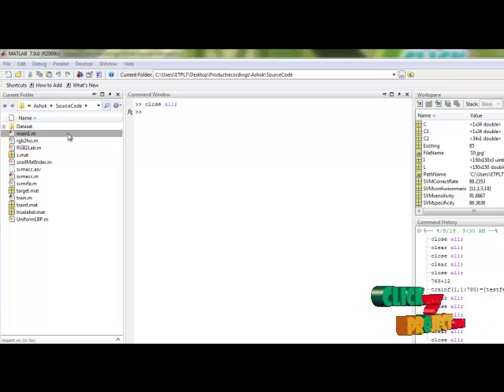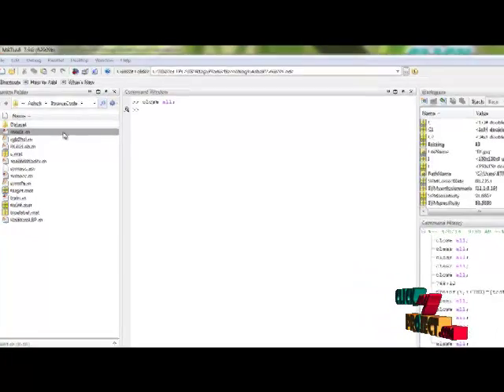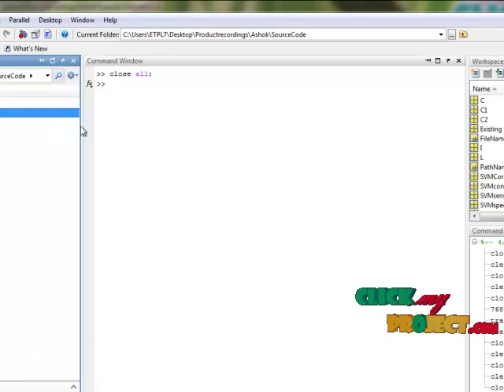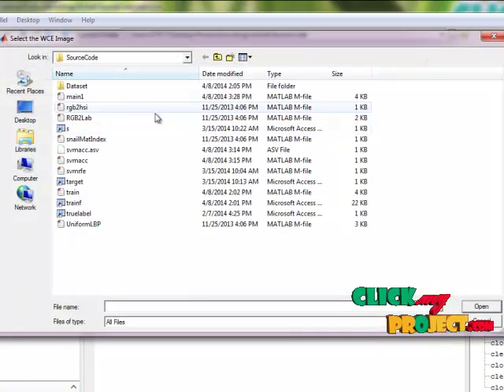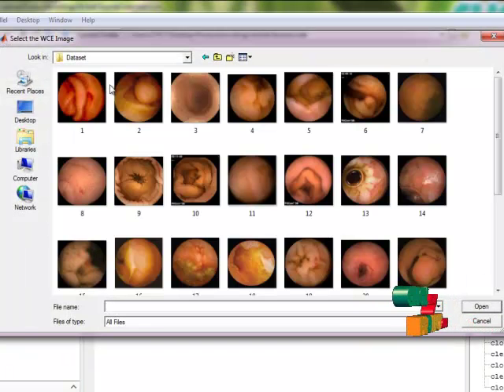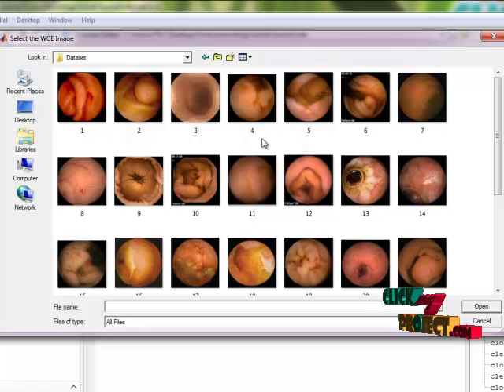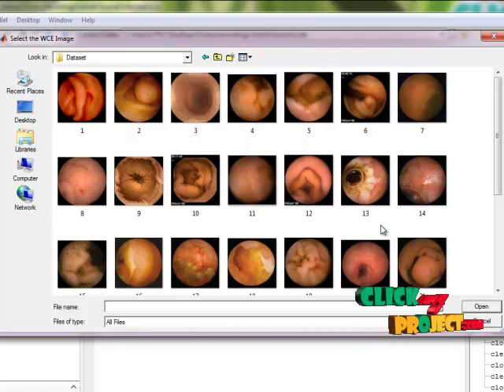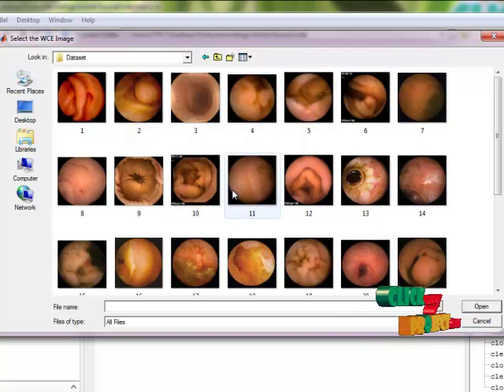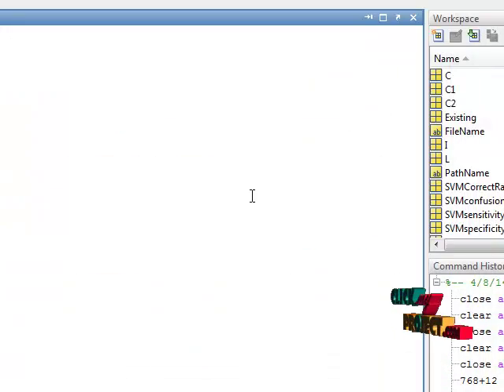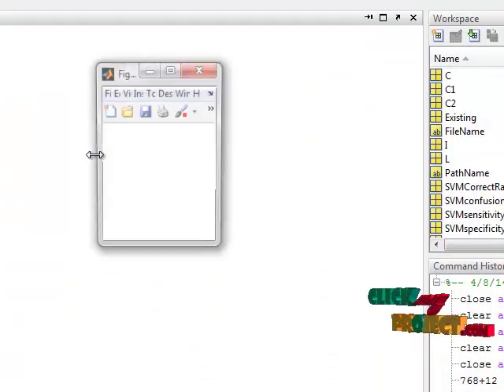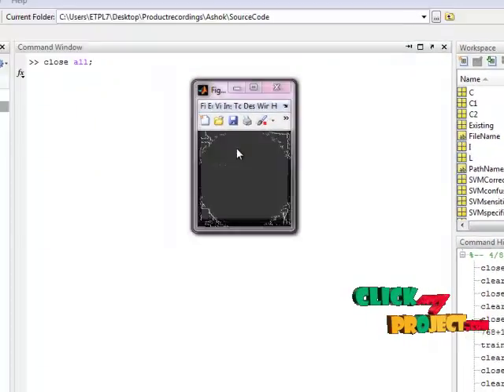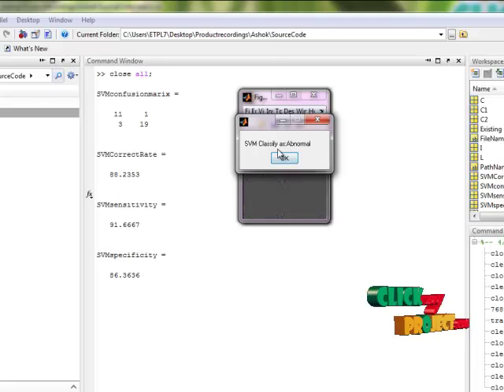Now let us see the execution process. First we select main1.m file and click run file. This opens a dialog box with wireless endoscopy images. We can select any one of these. Now I select this.